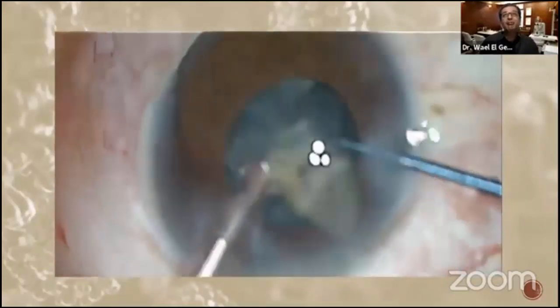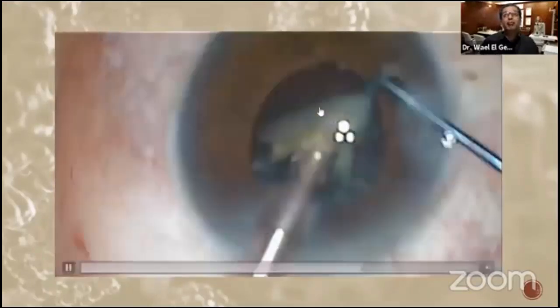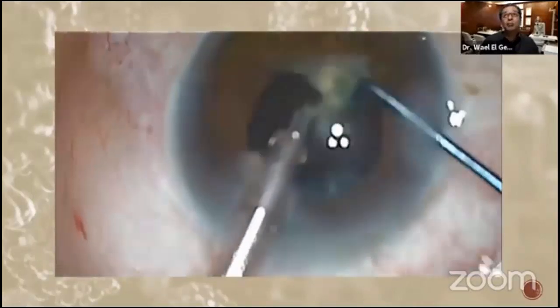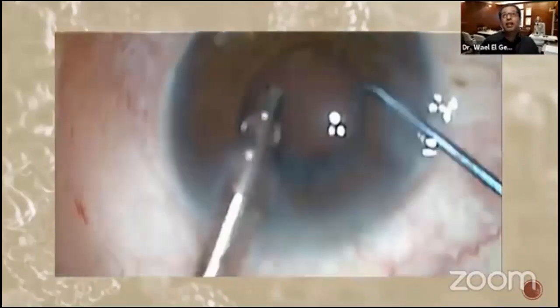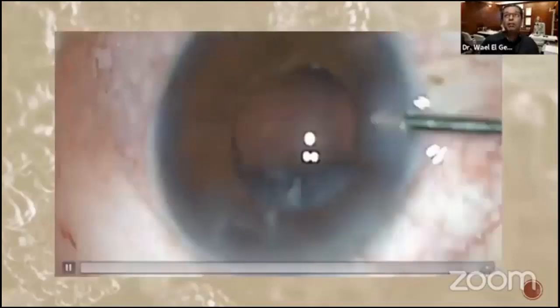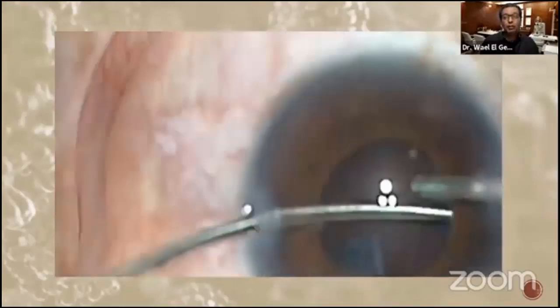In cases like this, I have very small epinucleus and very thin cortex. So at the end of my procedure here, I take my flow rate a little bit lower. So as you can see, the pieces will stop going in as fast as it used to go before. And I moderate my vacuum a little bit. You see, when I take out my chopper, it is because I want my fluidics to go in an efficient way. If my chopper is leaking fluid, then I need to take it out to make sure that the fluidics will bring all the small particles to me.